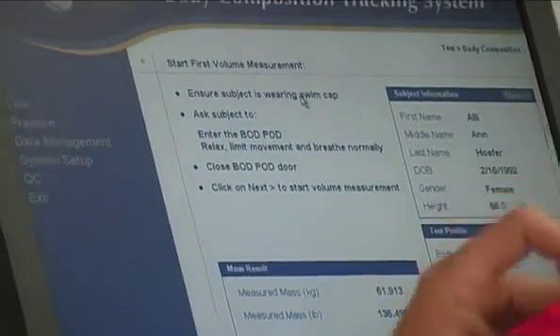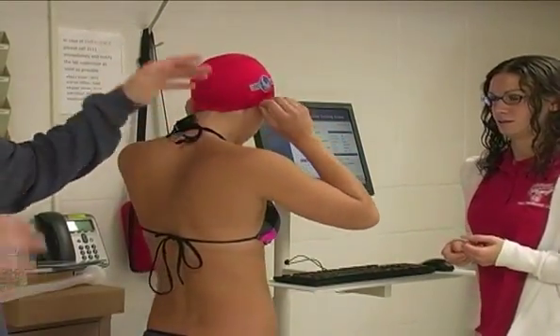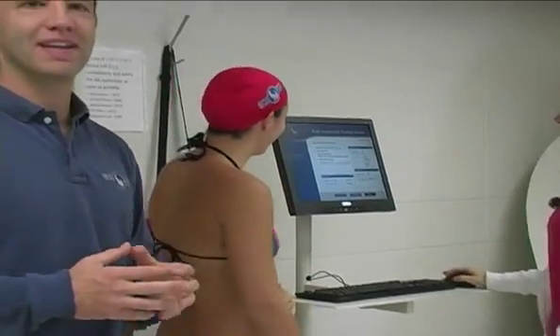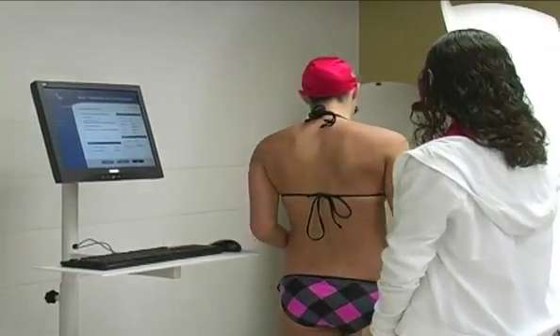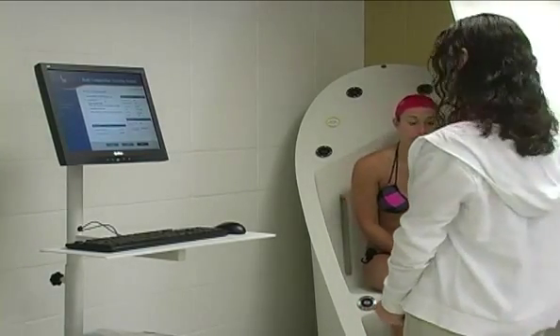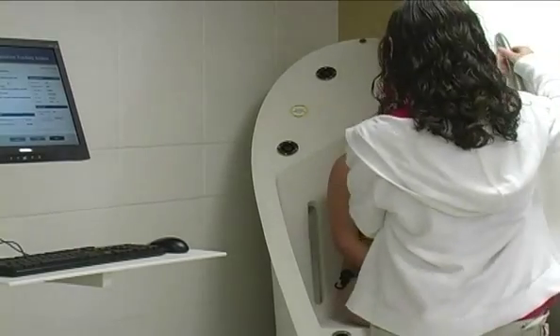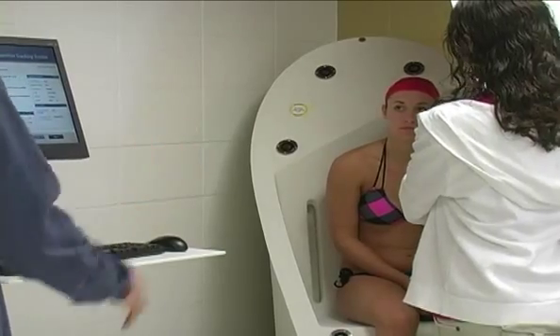She's going to wear this because there is essentially isothermic air that's in the hair, so the cap compresses that. If she gets in the BOD pod without the cap, the measurement's going to be inaccurate. Okay, so now you can get in the BOD pod. Same reason she's wearing a bathing suit. Just sit normally, relax, breathe normally. We're just gonna shut the door for about 50 seconds. So just breathe and do what you're doing. And you'll hear pops and clicks. That's normal. Those are the valves opening and closing.